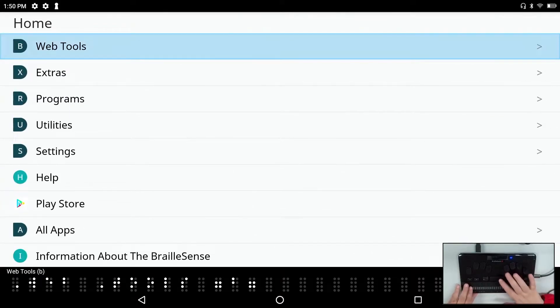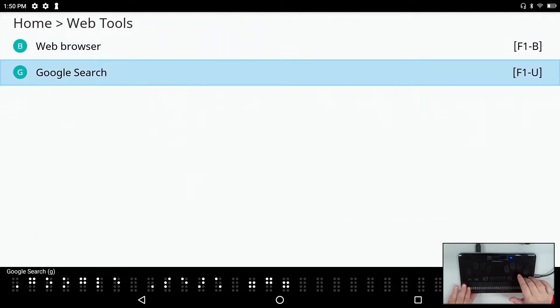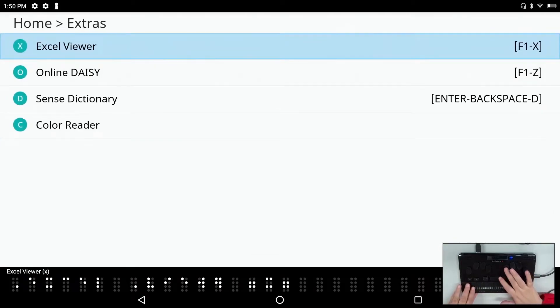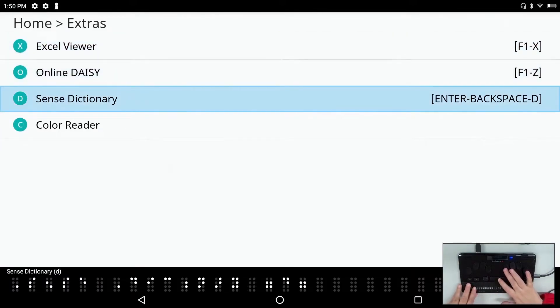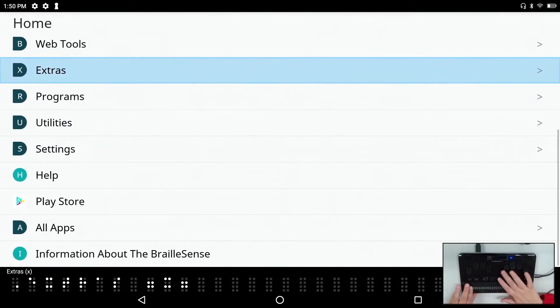Under web tools we have the web browser and Google search. Under extras we have the Excel viewer, online daisy, and the Sense dictionary — now included in every unit. Whether you have a license or not, we include English (US and UK), Spanish, Italian, and French. We also have a new application: a color reader.